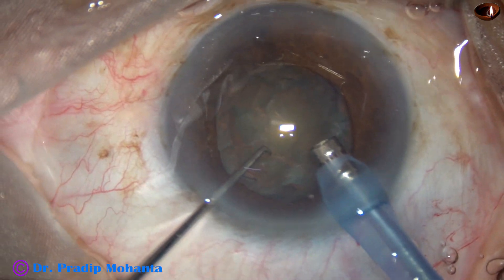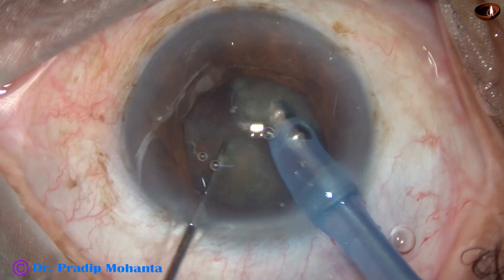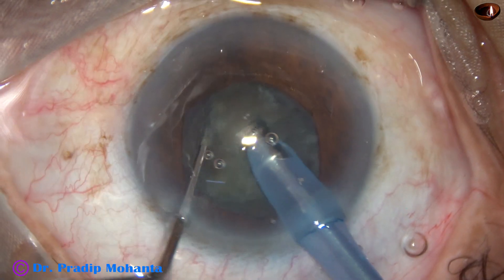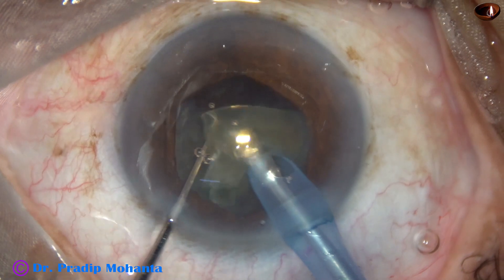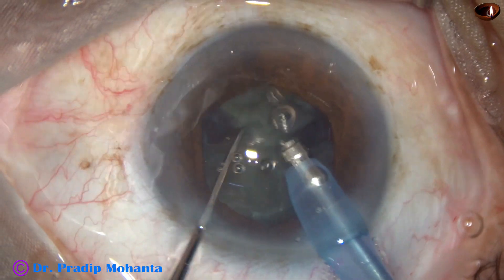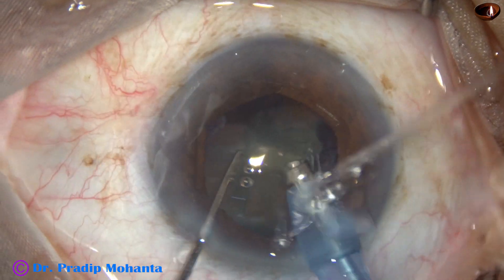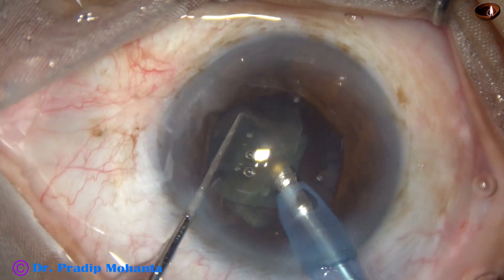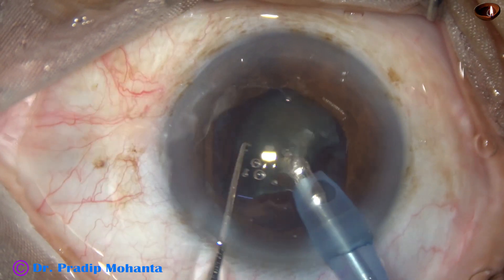And now my plan is to do direct chop. Nuclear sclerosis in this case is about NS2, and it is difficult to hold such a nucleus. So the chopper does the main job. The phaco needle remains at the center, just applying little vacuum and supporting the lens mass. And the chopper does the main job. Now the fragments are emulsified. The ultrasonic energy used is about 50 percent, flow rate is 45 ml per minute, and vacuum is 450 mmHg.